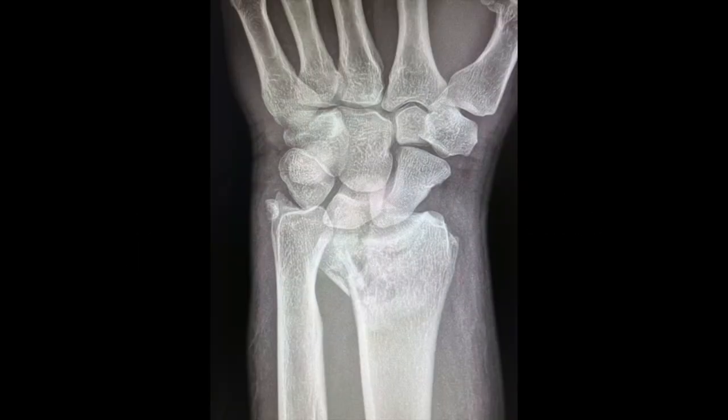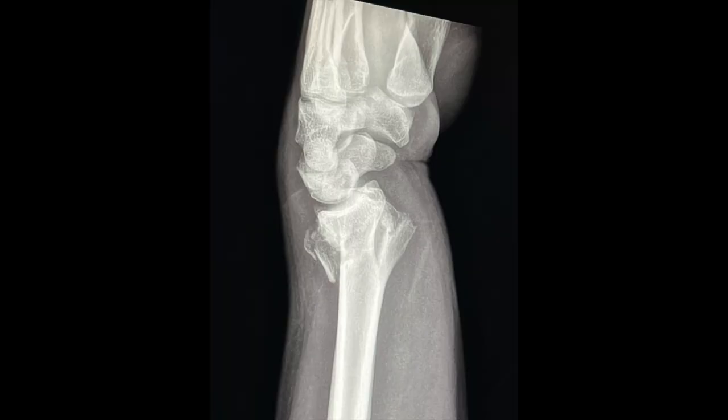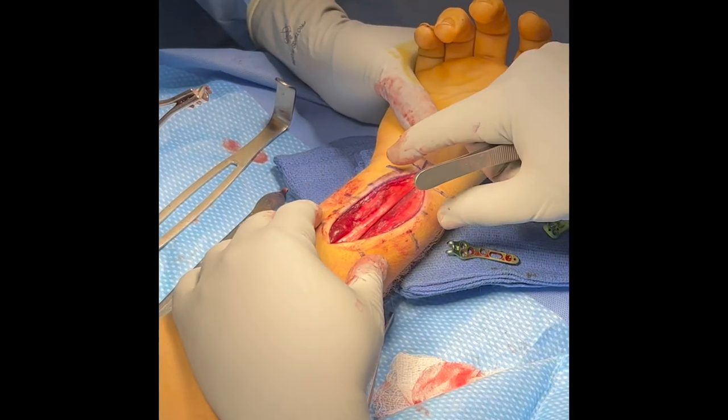This is a 26-year-old male with a very distal intra-articular fracture to the distal radius. These fractures can be difficult to fix with a single plate.